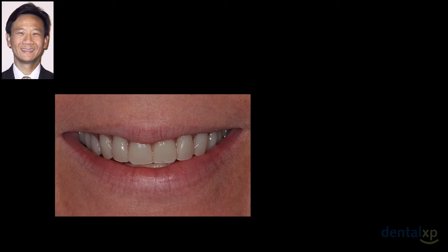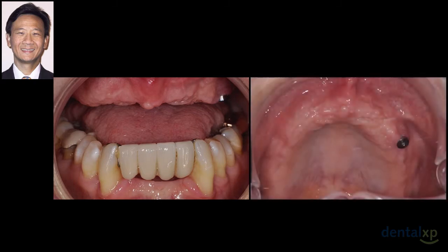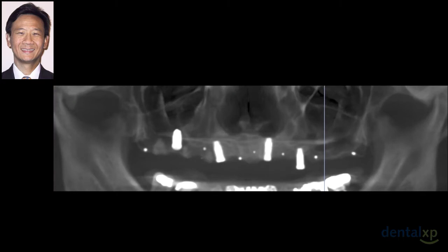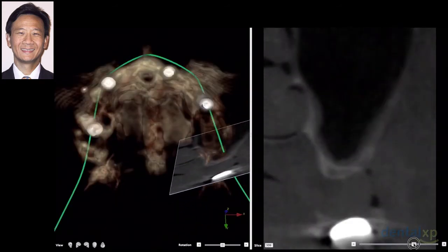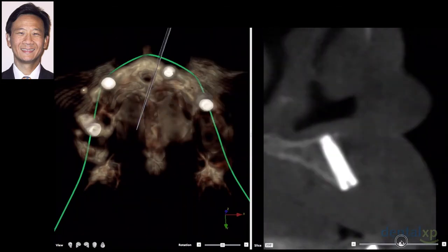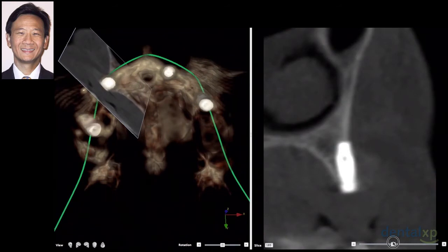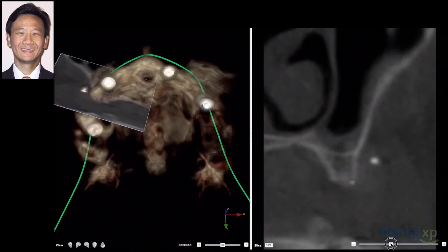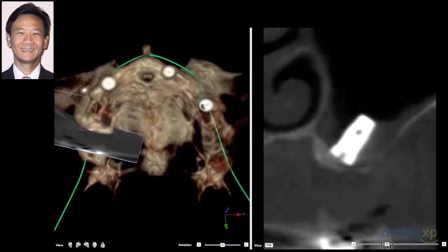When patients present, such as Liz here, with a complete maxillary denture and a history of implants being placed, as we evaluate these implants that were done, these implant positions that were stated, having a cone beam CT from our 9300 scanner, we can see truly were these implants where we needed to have the implants placed. Looking at these positions and the surgeon that may have placed these implants, what type of technology could have helped in really understanding these positions of implant placement? Did we get the implants really where we expected them to be?